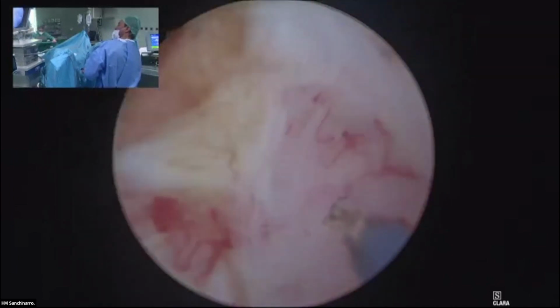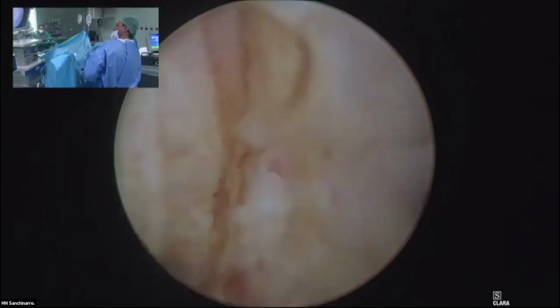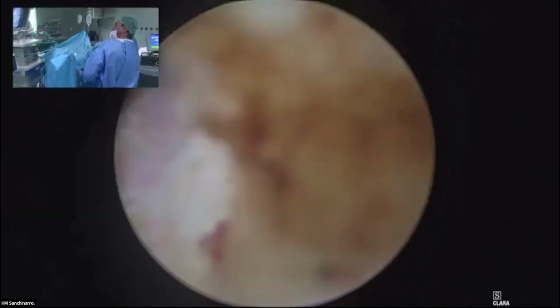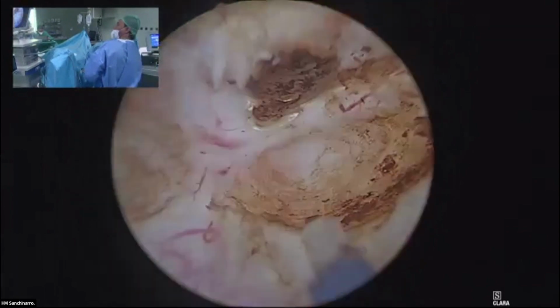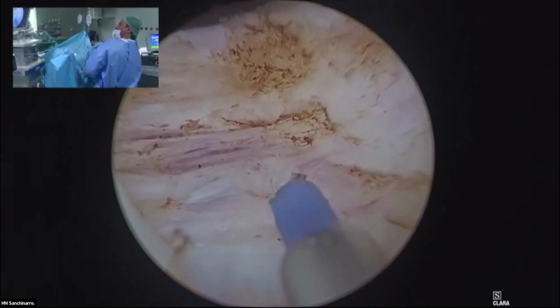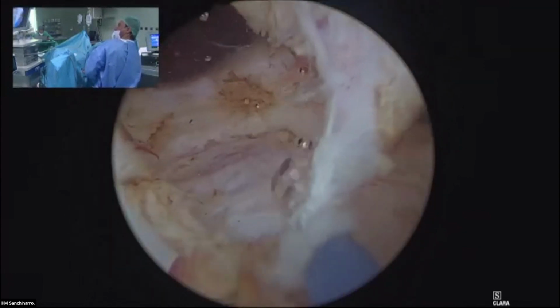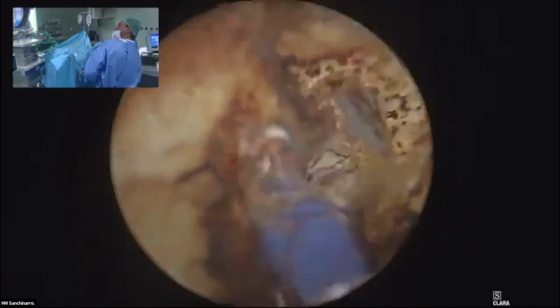You see, little traction. I feel that the plane is here, and I cut in between. A little bit of traction. I see the correct plane, and I cut in between. And this is the most simple part of the whole ThuLEP. Traction. Keep in mind that once you arrive really close to the bladder neck, you don't have to go straight, but you have to go up. Otherwise, you undermine the bladder neck, because of problems with the catheter or a bleeding.